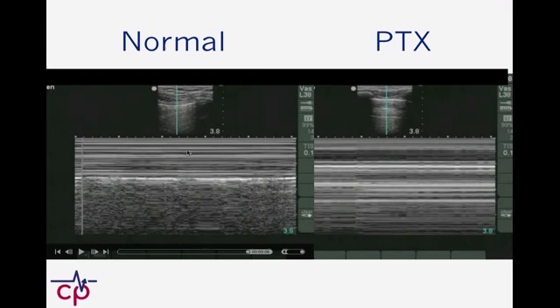All these structures are static with respect to the probe, so you just get this linearity. Nothing's moving. Whereas lung and pleura and all that immediately below what you're looking at, assuming there's no interposed airspace within the pleural space to diminish your image quality, is going to give you this kind of movement of stuff below it. Well, not really random, but movement that gives you artifact down here, gives you this granularity.